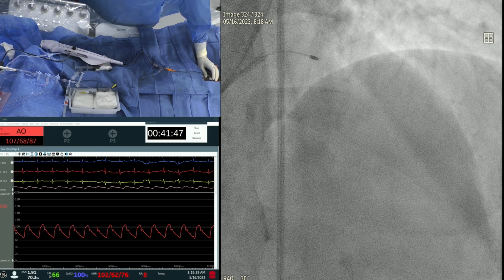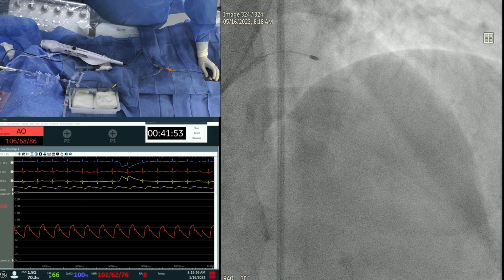Make it up. It's in the bottom. And point it towards us. I need to see the number. Good. Yeah, fine. Let's go.